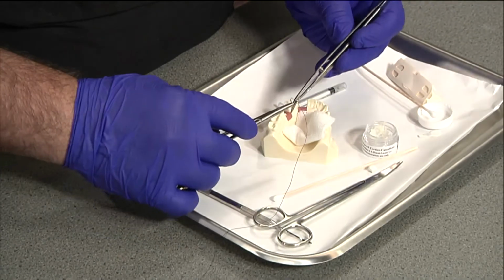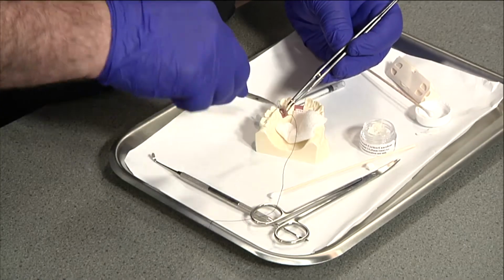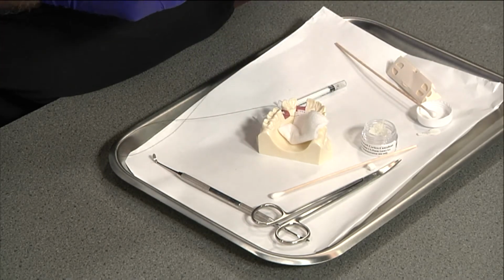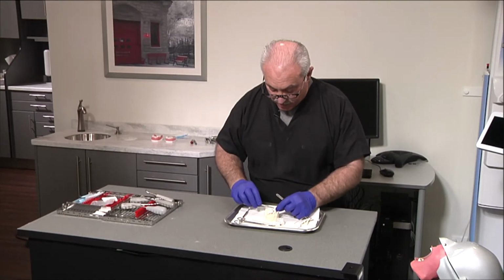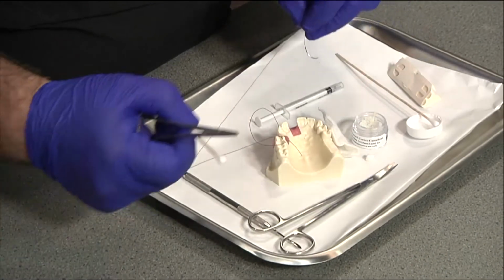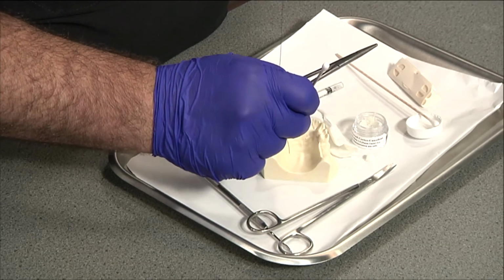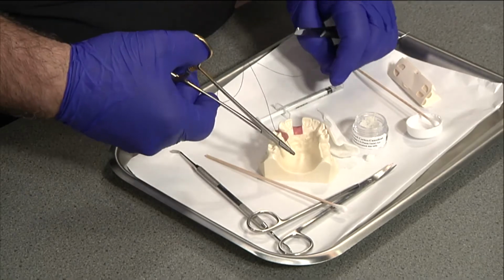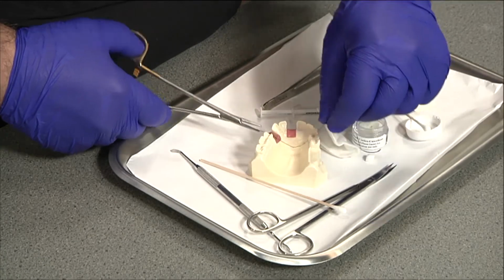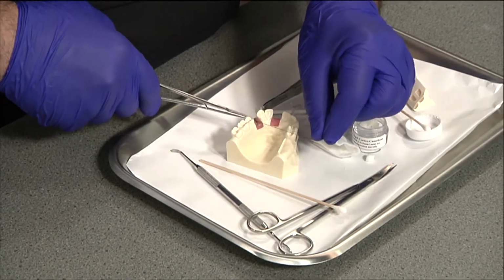And I will honestly tell you that it's easier to sew oral mucosa than the simulation gingiva. Make your pull so that you only have about 1 or 2 inches protruding so that you don't have a tail being contaminated. And here's where your assistant comes in handy as you are bringing your knots. They're holding that collagen plug in place. It's almost like wrapping a Christmas present. When you're putting the bow on, you need that third hand to hold that in place. And then just a simple square knot with a third throw to secure it.